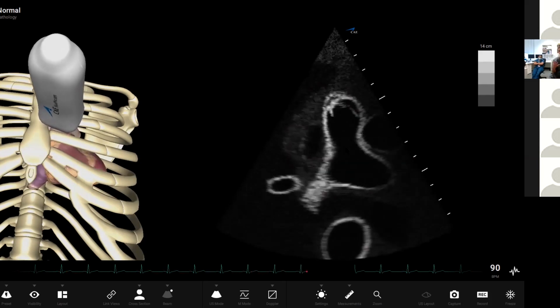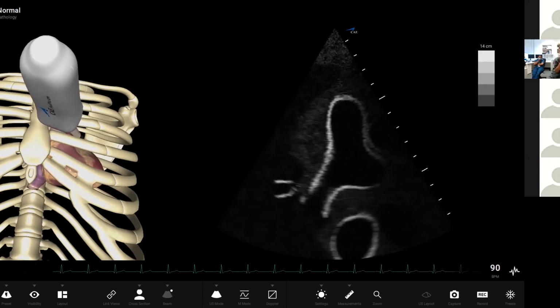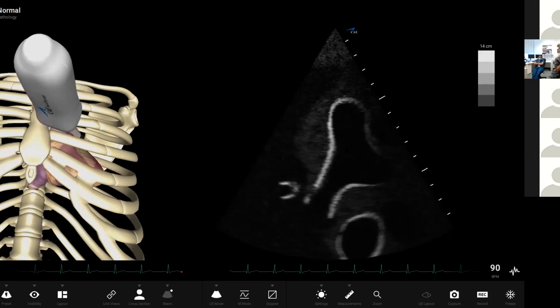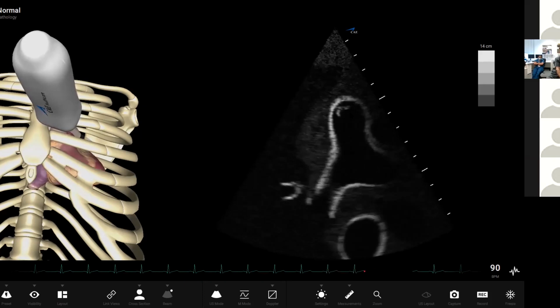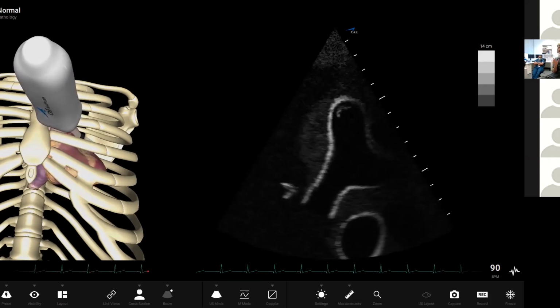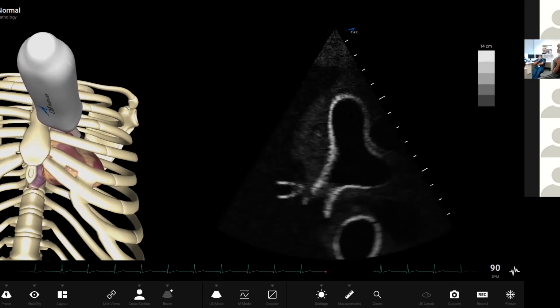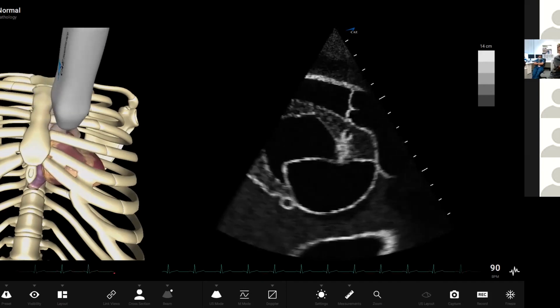I guess the tip and trick talking about hemodynamics in this, if we're trying to figure out whether the patient has significant pulmonary hypertension, obviously we're looking for tricuspid regurg, but also don't forget with the pulsed wave Doppler at the RV outflow tract, looking for that flying W. And that's one of my favorite things for looking for significant pulmonary hypertension, because it's easy to do. You can't really cause that by inadequate imaging, but you get a nice view down there for your pulmonary valve. Okay.